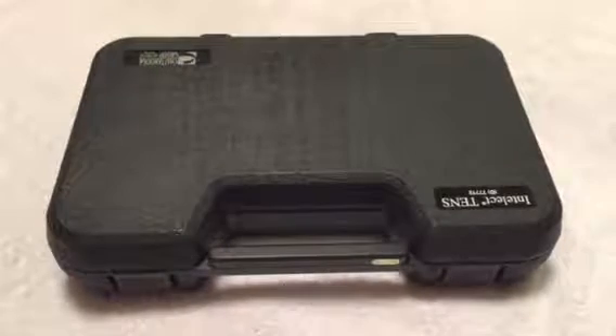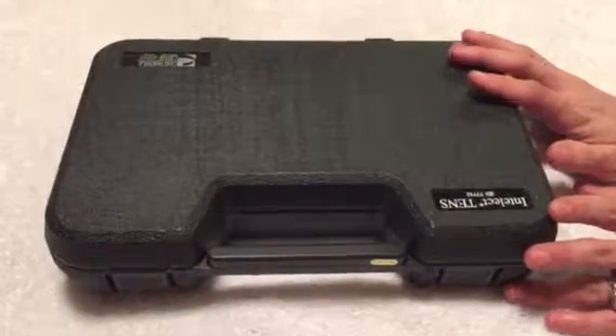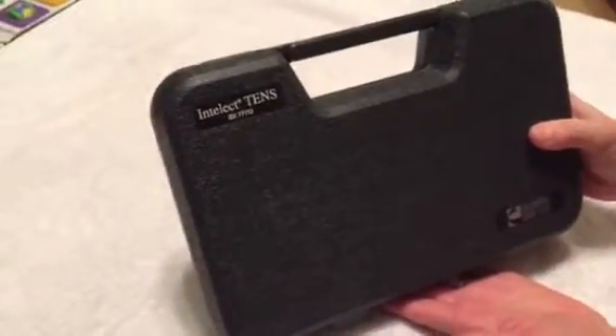So when a patient gets admitted onto your unit, either they will request or you can suggest use of the TENS. This is what our new units look like. They come in a hard plastic case that are kept in the Pyxis.